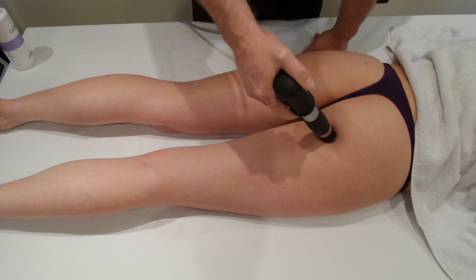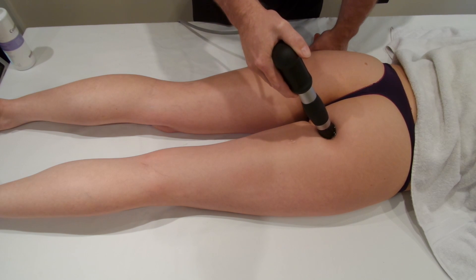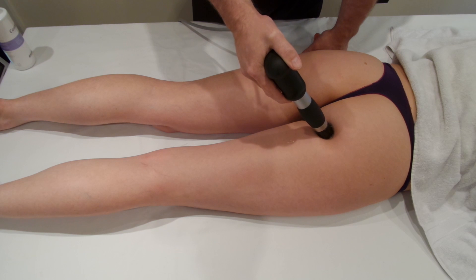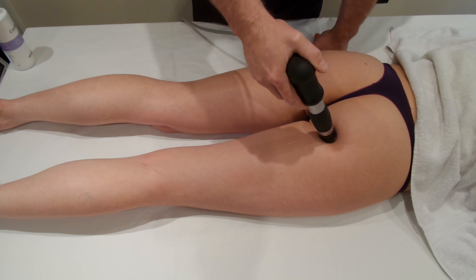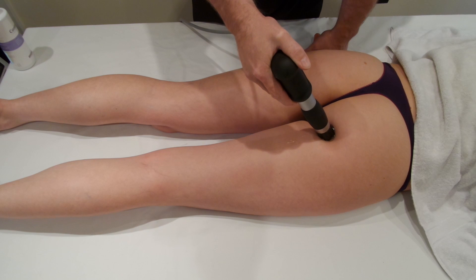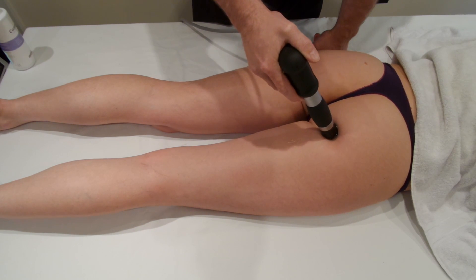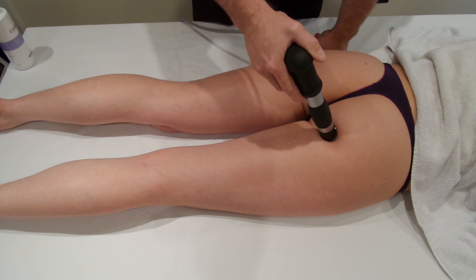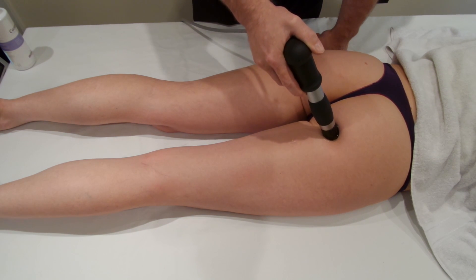In terms of energy levels, 120, 150, 180, or 85 millijoules would be fine. We're not going to go as high as the 0.6 millijoules per millimeter squared that Rompe et al. used in 1998, but somewhere in the higher levels is a good number. We'll do 2,000 shocks at this area and let the shocks run through.